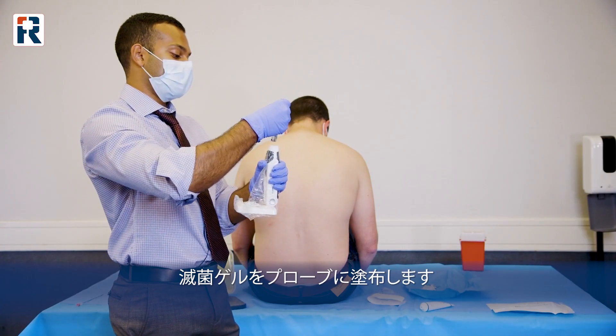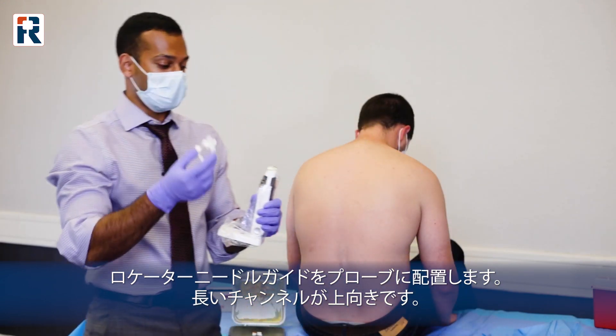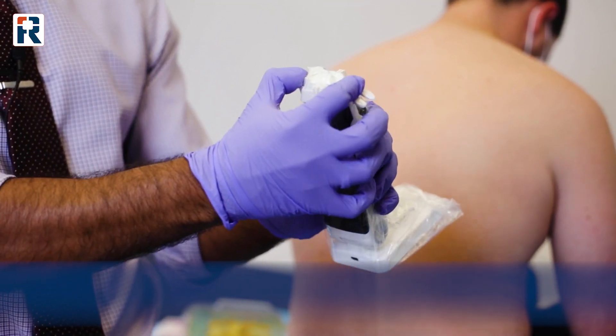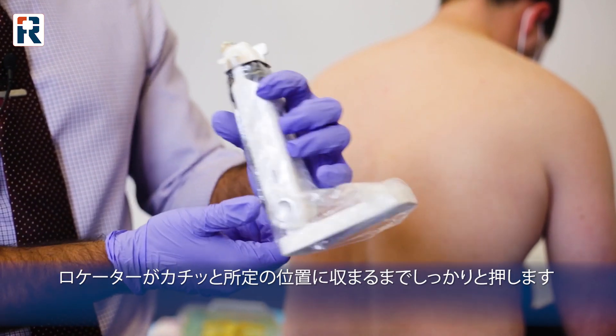After that, you're going to put your gel on this, and you're going to place your locator needle guide, which is also in the pack. The long end is going to be facing upwards. You're going to push down firmly and you're going to feel it click into place. After that, you're set up to start scanning.